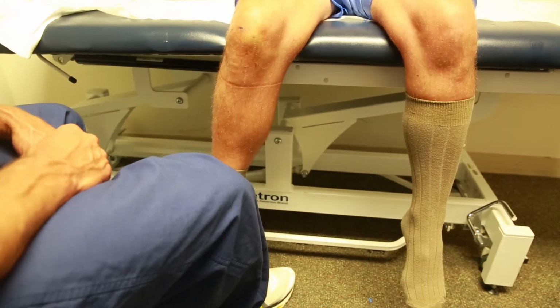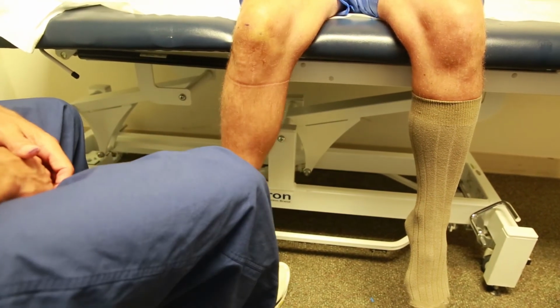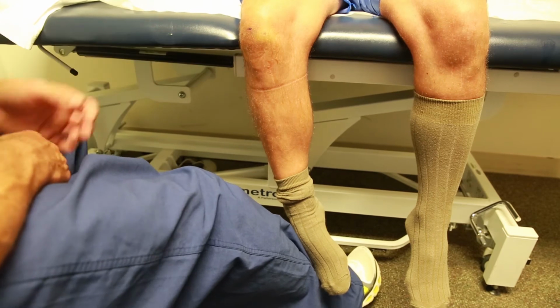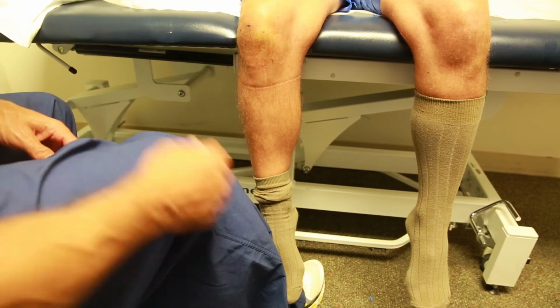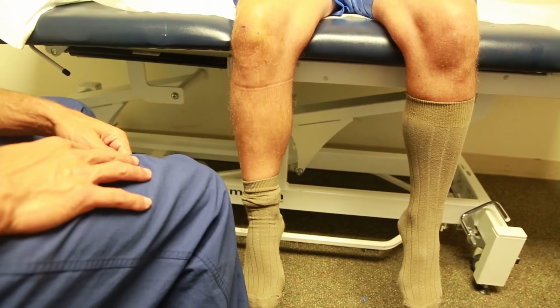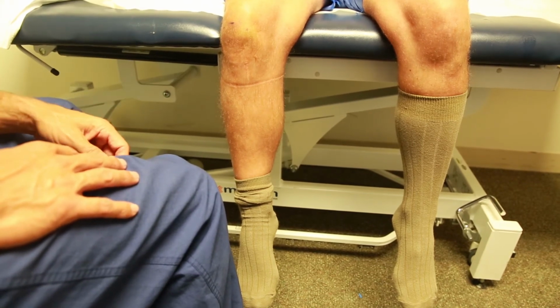You can also add a valgus moment on the leg to open up the medial compartment by taking your lower leg and pushing it this way. Then you can put a varus moment by just taking it this way. So it opens up the lateral compartment or the medial compartment. It allows you to flex the knee, but it's very difficult from here to get extension. You can't do it. And while this will work, I think it's advantageous to have the patient lying flat and keeping the leg straight to 30 degrees because that's where you do most of your meniscal arthroscopy.